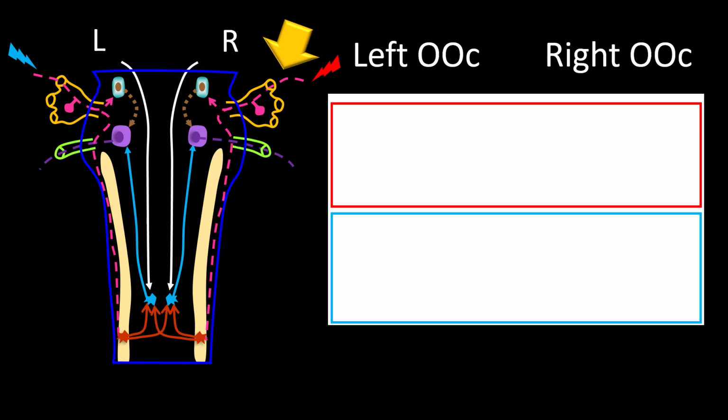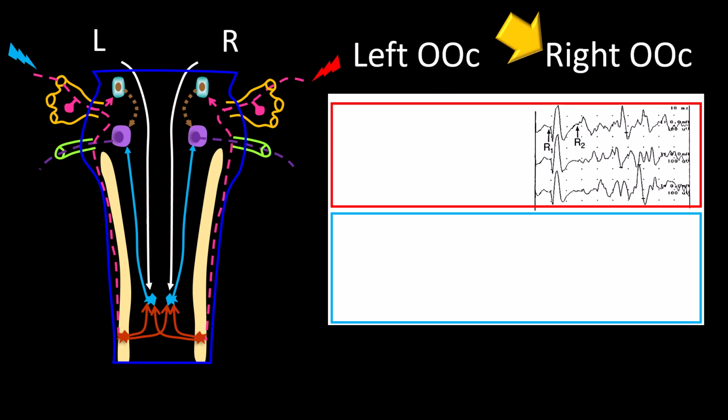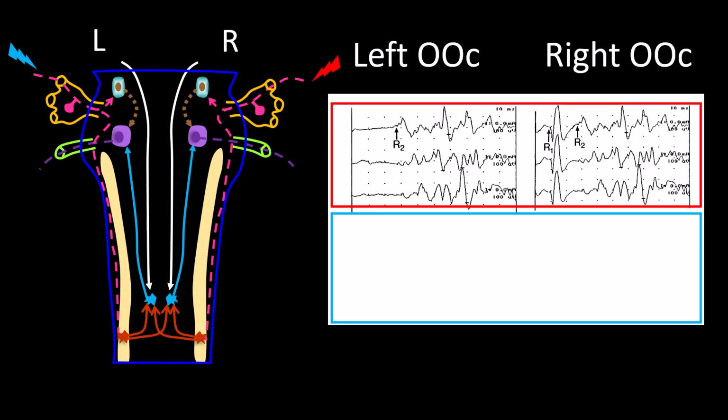Upon 3 single stimulations separated by 15 seconds of the right supraorbital nerve, the electrode on the ipsilateral orbicularis oculi will record 3 tracings, one after each stimulus. The machine will select the best of the 3 tracings and label it. The technologist nonetheless has the possibility of changing this selection if they choose to do so. In this case, the top tracing was chosen, so R1 and R2 ipsilateral were labeled on the right and R2 contralateral on the left. The second study is done by stimulating the left supraorbital nerve.